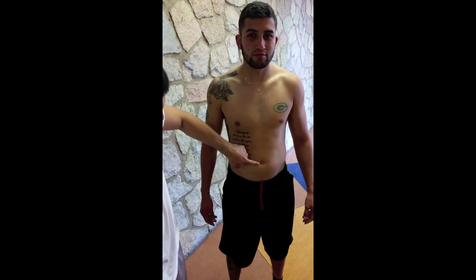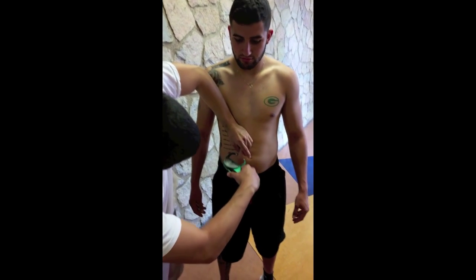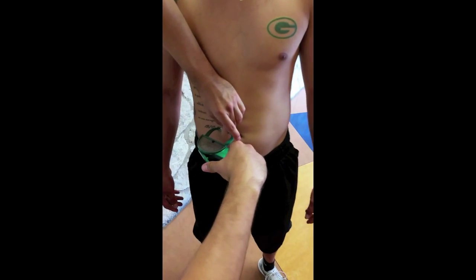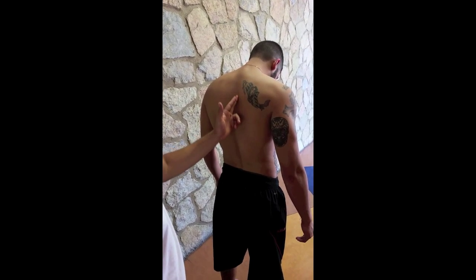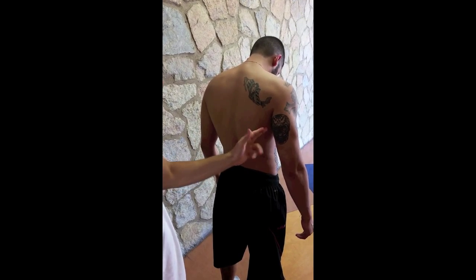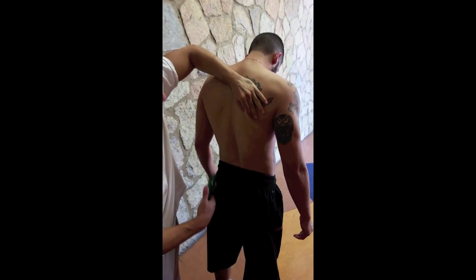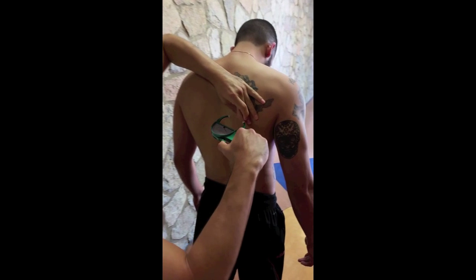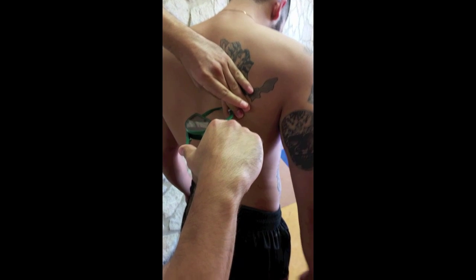When measuring the participant's abdominal region, you will commit to a vertical fold 2 centimeters to the right side of the umbilicus. When measuring the subscapular skin fold site, you will commit to a diagonal fold which is at a 45-degree angle and should be 1 to 2 centimeters below the inferior angle of the scapula.